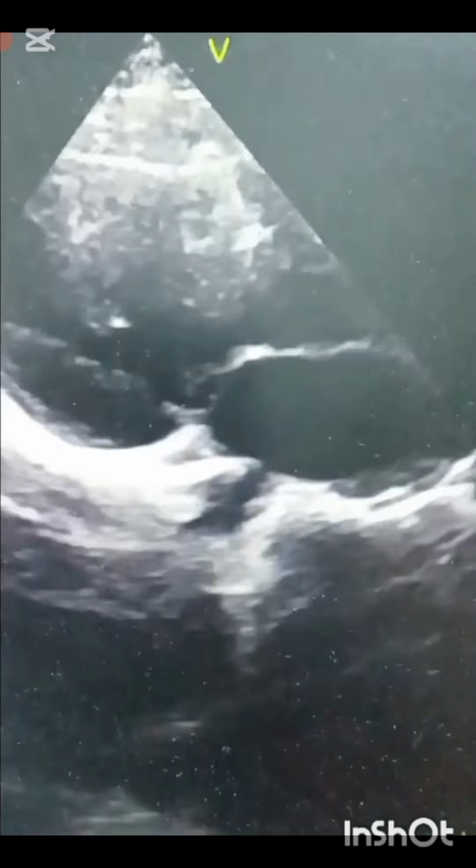Now you can watch this full video, where you can see the subaortic ridge and the cleft mitral valve also. Watch the full video.